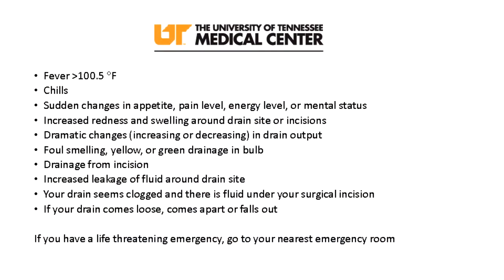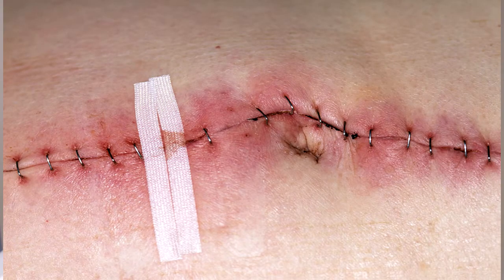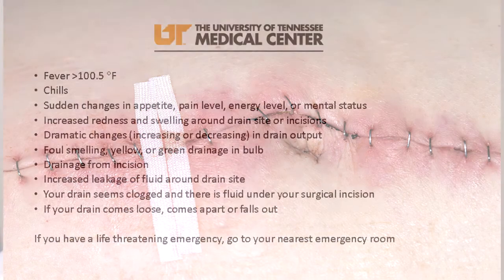So now we'll go over the signs and symptoms you need to be aware of going home with your new JP drain. First, we'll start off with fevers over 100.5, chills, sudden changes in your appetite, your pain level, energy level, or mental status, increased redness or swelling around the drain site or incisions. It's important to note that it is normal for there to be some redness around your drain site. However, anything greater than about a quarter-sized coin in diameter is a reason to call your physician.